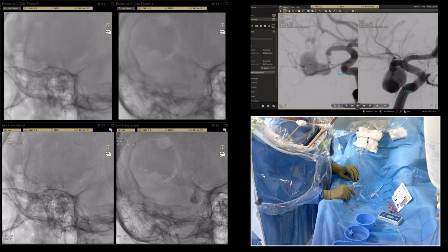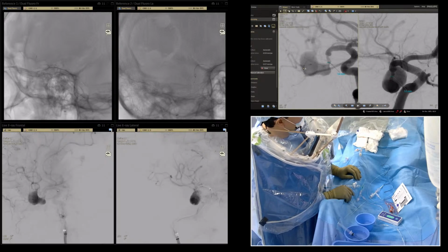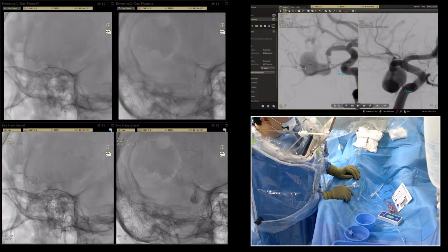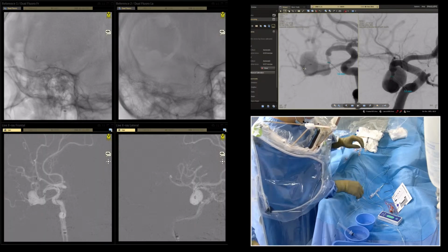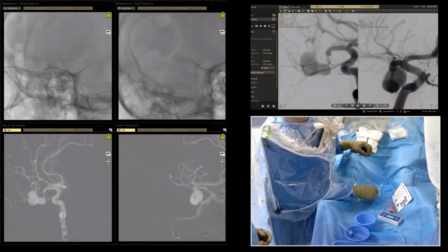It's quite distal, huh? We can bring a little bit, but then stent may move. There is a flow from bypass, that's why it looks like something like thrombus, but there is no thrombus. There is a flow from bypass.